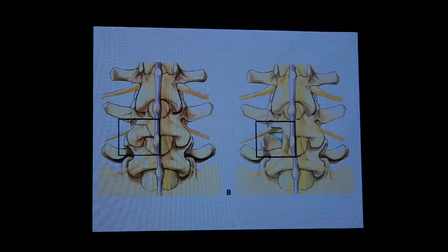As soon as you have exposed the facet joint and the pars and the lamina, you drill and take out the inferior articulating process on the concerned disc space. Then you do a part of dissection over to the superior articulating process, the SAP. You see the traversing root, and this is the exiting root. Once you have identified this, then you will be able to perform the surgery.